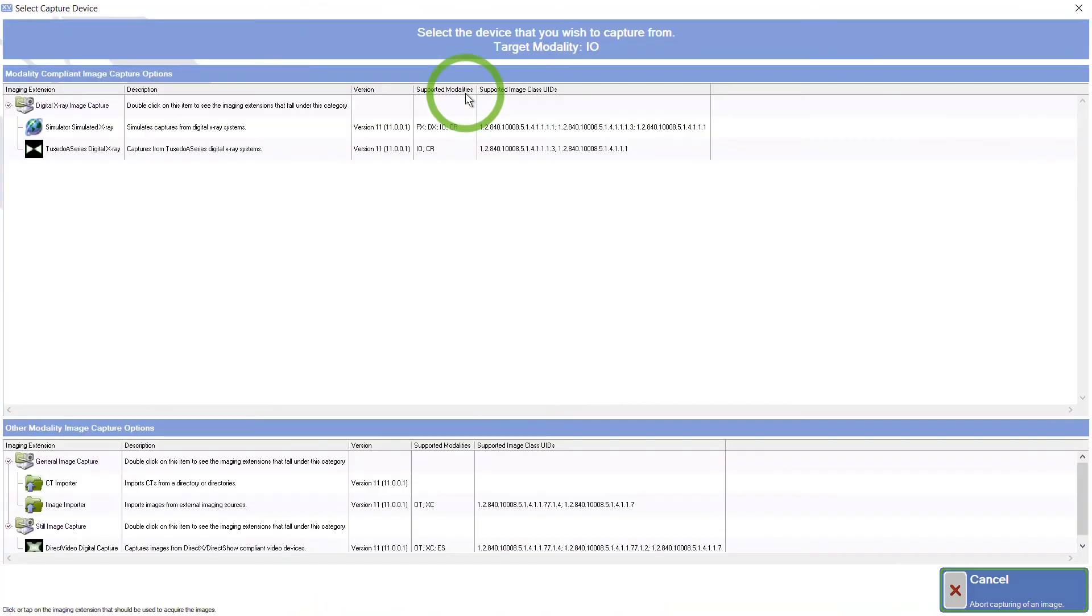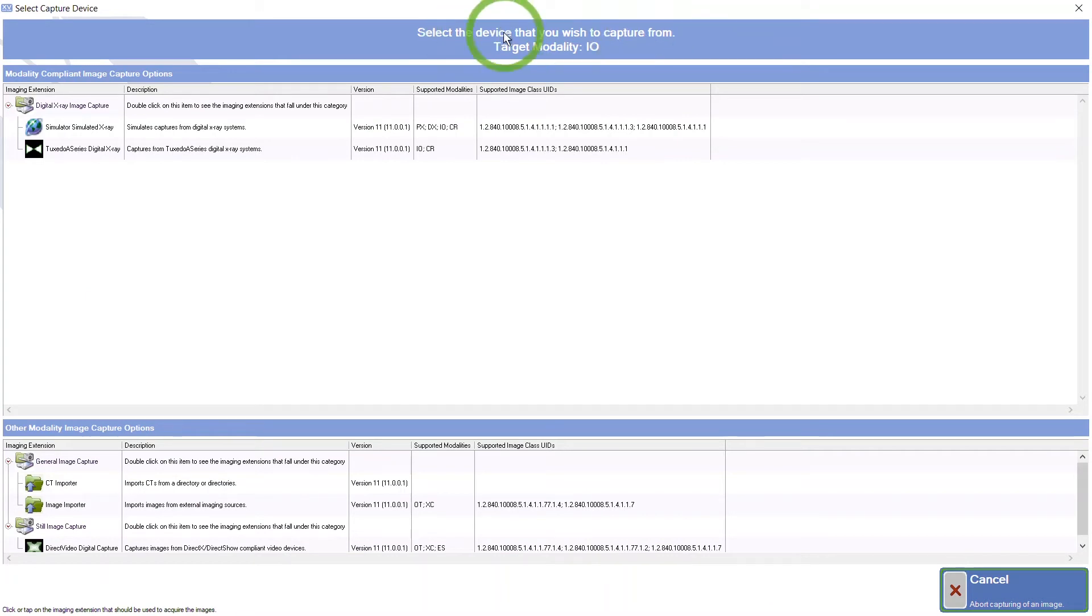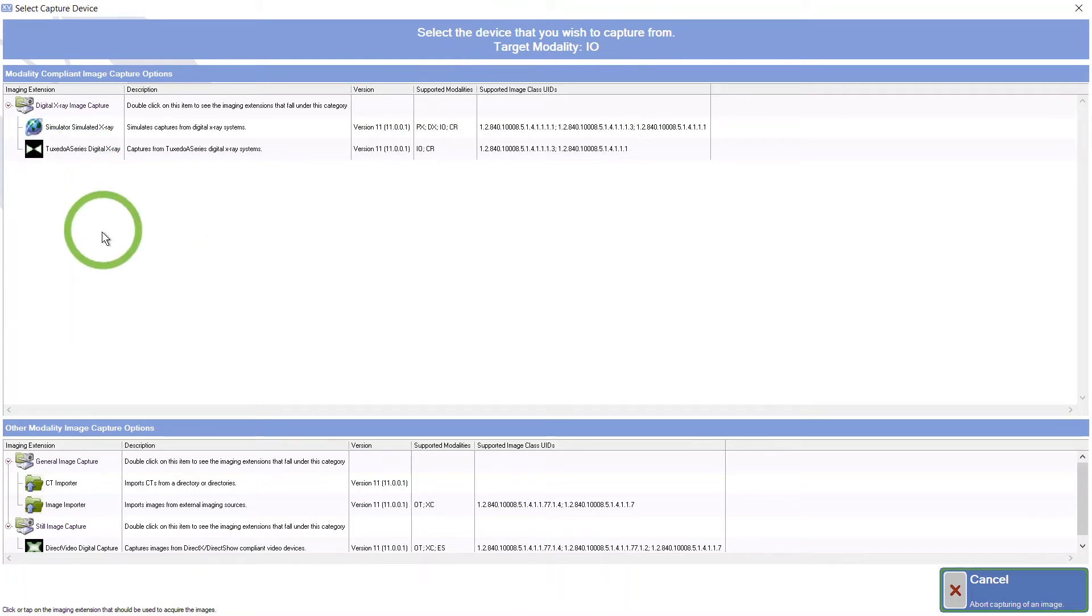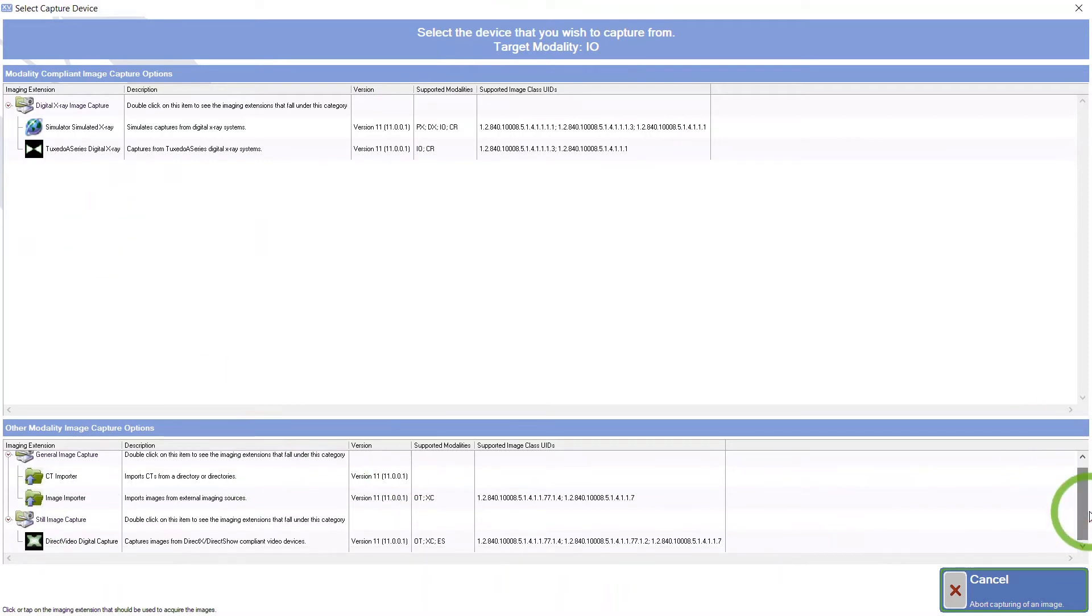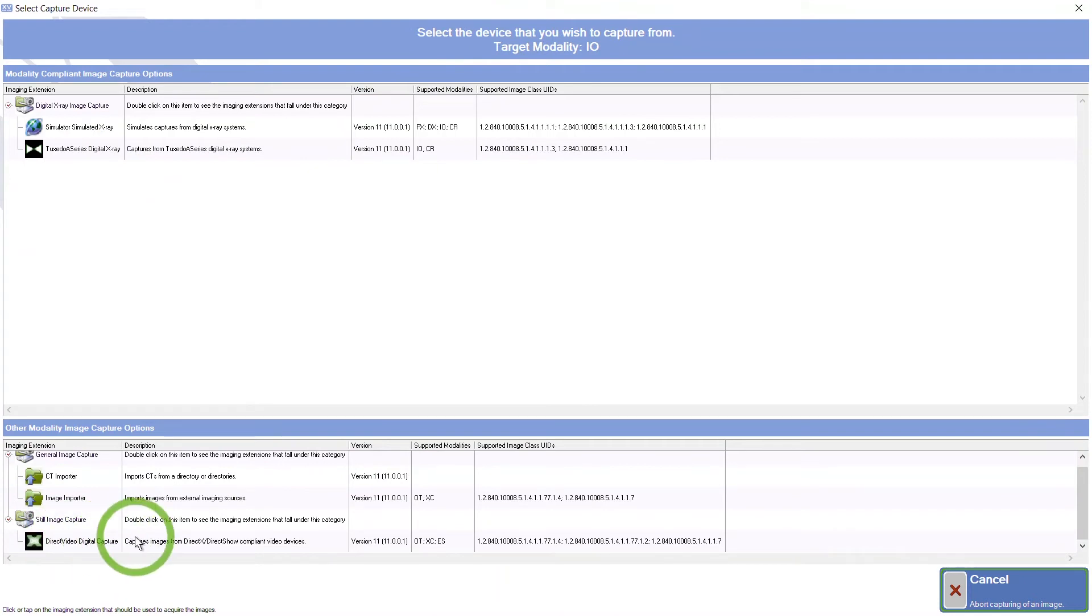We then have to tell the software exactly what device we are using. We want to make sure that whatever sensor we have in our hand that we're going to use to acquire those images, it will be listed here, and we want to make that selection. The lower part of the screen shows if you're importing an FMX 18, or if you're wanting to use your digital, the direct video, which is your intraoral camera, you can do that too. So select the device.